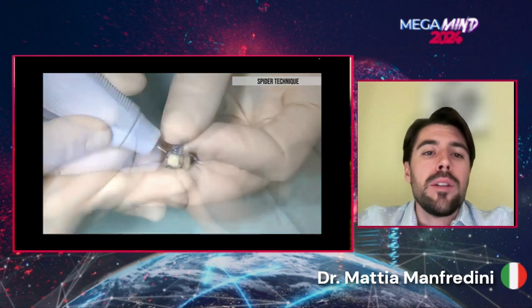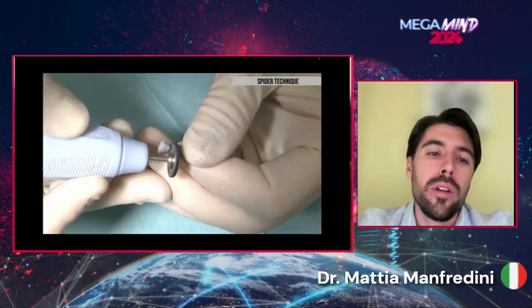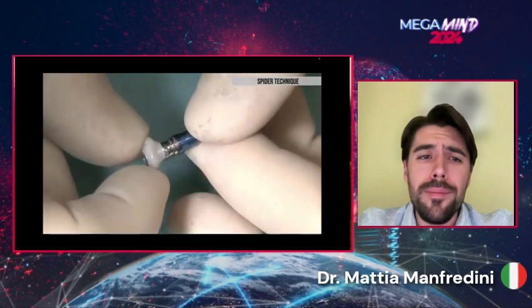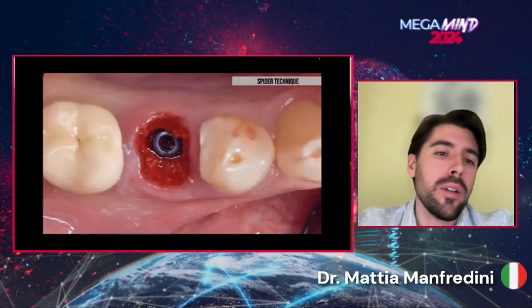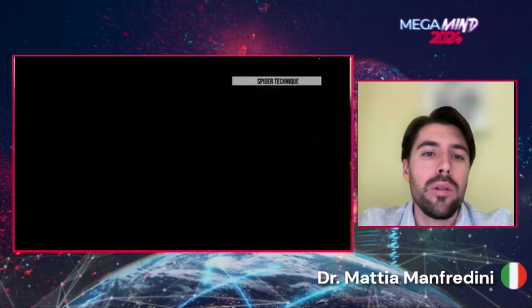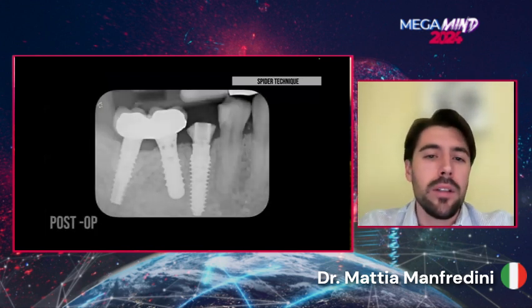Removing the temporary abutment, we can fill the gap between the root shape and the shoulder of the abutment, not the shoulder of the implant, because we need to stay straight in the connective area. We're gonna polish as much as possible the surface of our customized healing abutment with different kinds of burrs, one for the titanium, one for the resin. We fill the gap with Xeno because we want a low resorbable material in order to preserve the corticals as much as possible. And we can place with no stitches our customized healing abutment that replicates exactly the shape of the extracted root.